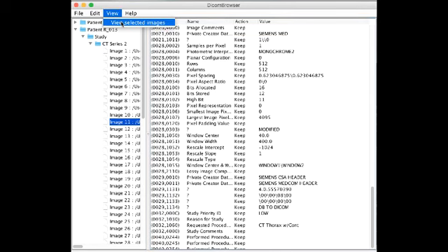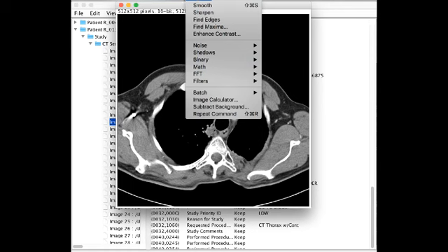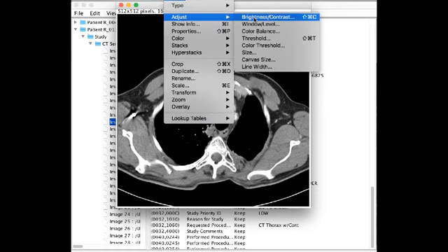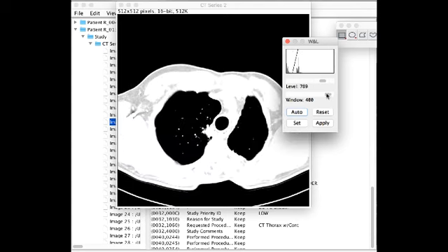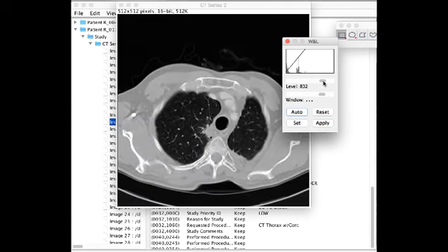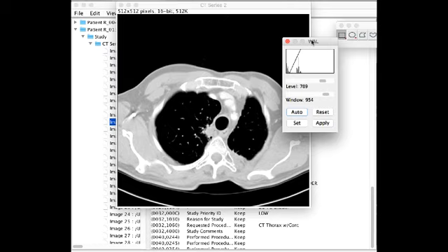Now we can also view the image. So look, you'll see this particular CT slice. It's 512 by 512 pixels. You can adjust the imaging. DICOM browser is actually using ImageJ to do this. So there's lots of tools that come with that. You can measure pixel values, draw regions, etc., etc.